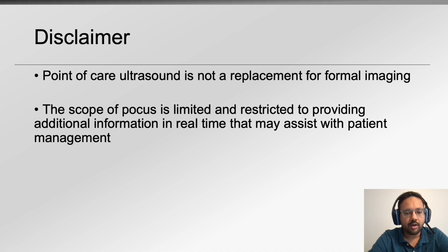One big thing that I always talk about when I talk about point of care ultrasound is that it is not a replacement for formal imaging. Generally, the scope of POCUS, especially in developed countries like the US, is limited and restricted to providing additional information in real time. We do not use it as a substitute for radiology, and I would recommend the same for all of you who are learning this as a new skill.